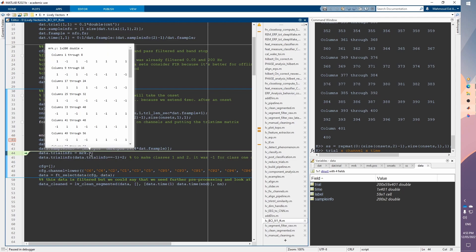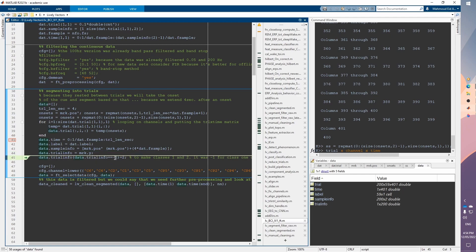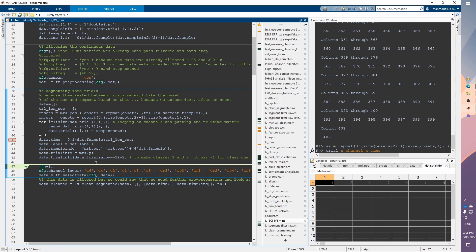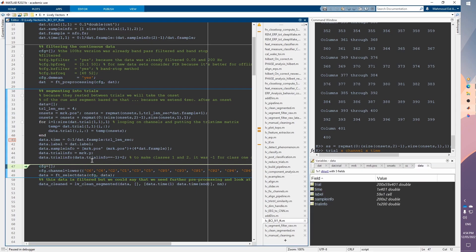After that I copy the trial labels: mark.y contains the class label for every trial. We have 200 trials — some labeled left hand, some labeled right hand. For simplicity in the analysis, I change labels of -1 to 2: I check where data.trial_info equals -1, get those indices, and set them to 2. This makes it easier for classification analysis later, but it's just a marker for right hand versus left hand activity.